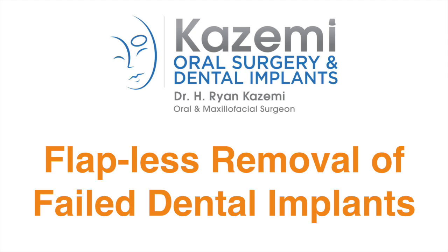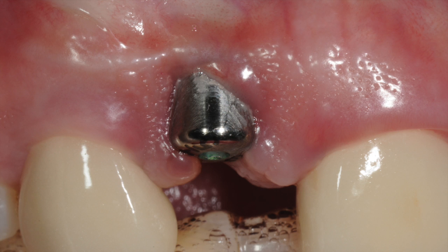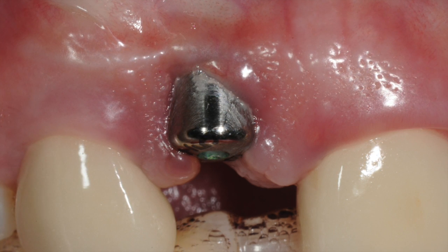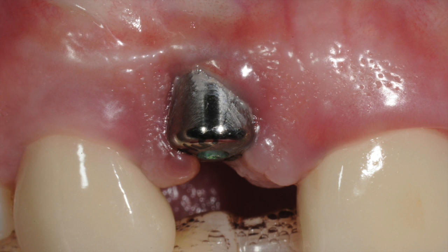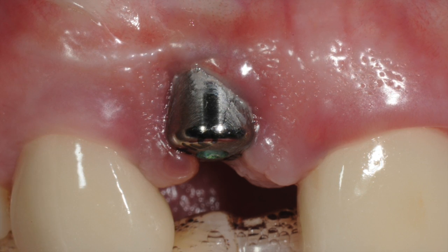This non-invasive approach greatly improves the healing, lessens patient recovery, and also reduces post-operative pain. Here is a patient who had a dental implant placed in a very poor position and it was misaligned. The position had already caused some recession of the gum tissue and significant inflammation.